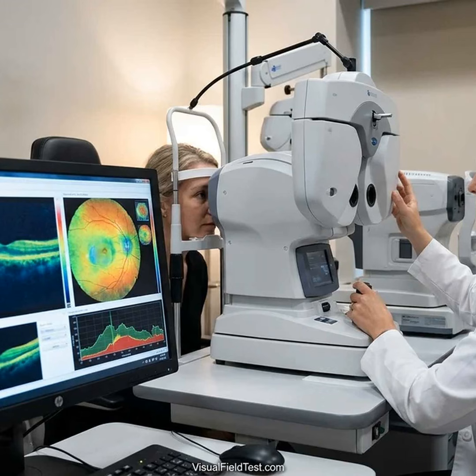What OCT measures and how to read it. OCT produces detailed images of the retina, which doctors interpret in simple ways. The main thing OCT measures is retinal nerve fiber layer, RNFL, thickness. This is the layer of nerve wiring that runs from the retina into the optic nerve. Glaucoma causes this layer to thin over time. OCT scans circle the optic nerve and report the RNFL thickness, often as average thickness and in each quadrant. Thinner than normal RNFL can indicate glaucoma damage.